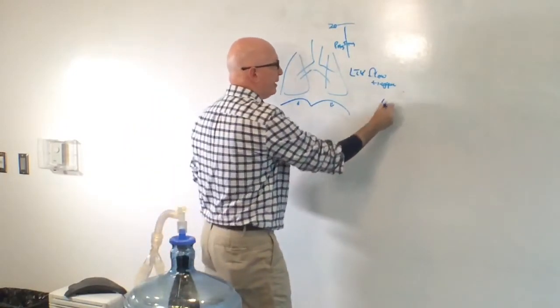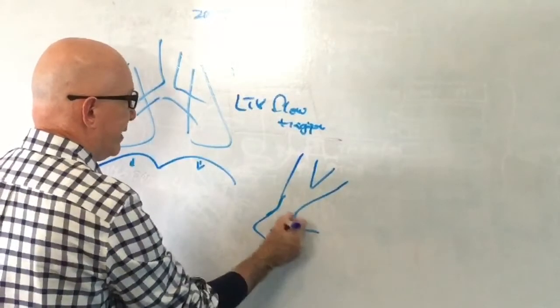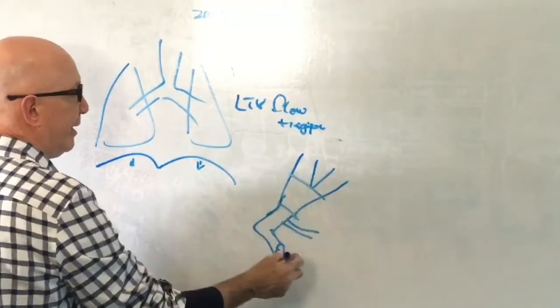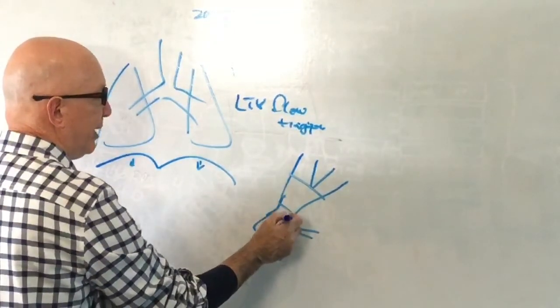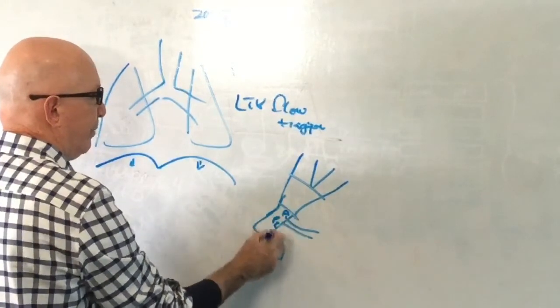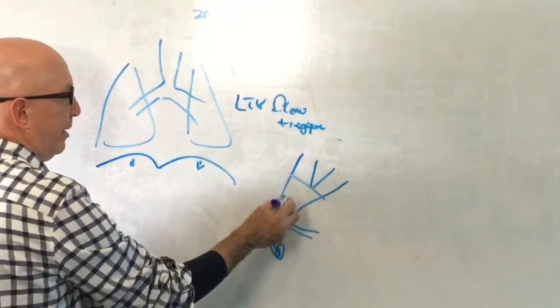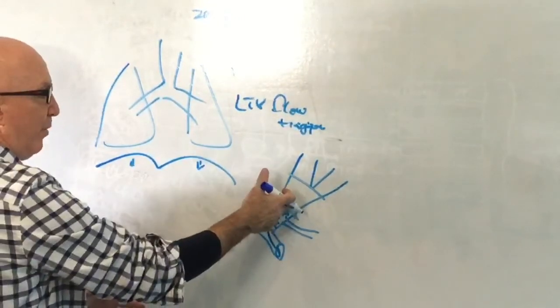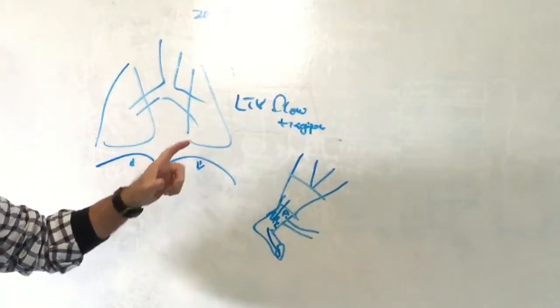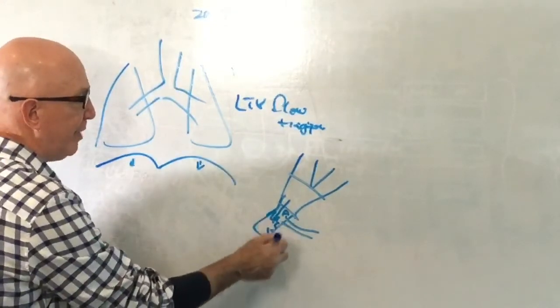But just very quickly to recognize what that actually means is that the sensors that come off distal to the Y of the ventilator circuit connector measure 2 pressures. So there's a P1 and a P2. And when a patient inhales, flow is going past these 2 sensors. And so simply because of the way flow is created, where it is generated from a high pressure to a low pressure, P1 has to be greater than P2 if we're in inspiration.